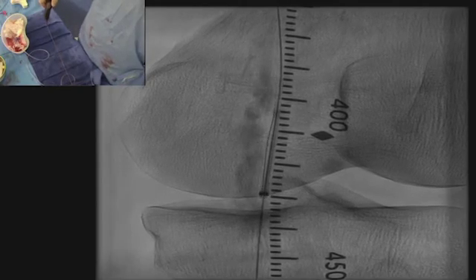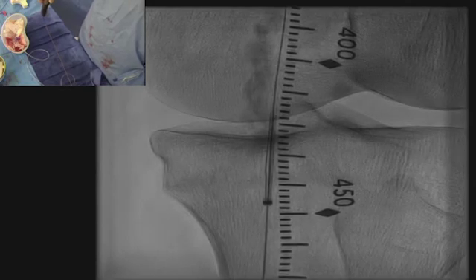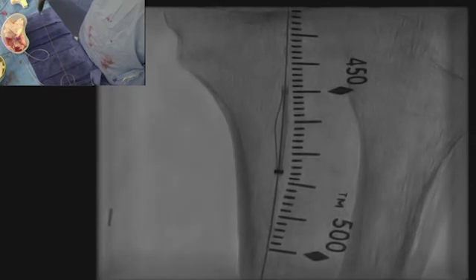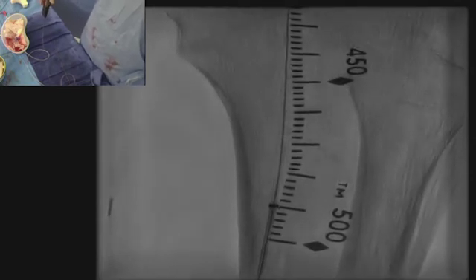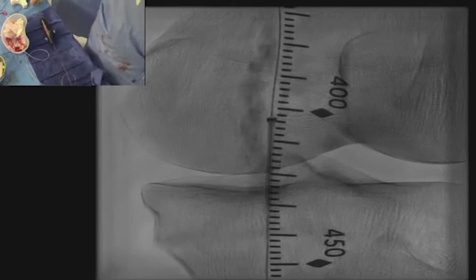Now, both areas are getting flexed in, indicating that we are within a very high-grade stenosis area. This is an excellent example where the area that is being treated is extremely tight to the point that the device completely flexed in. Once it goes beyond that, it will flex out again.